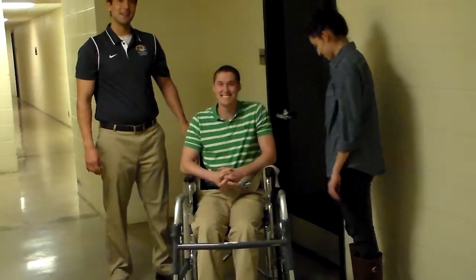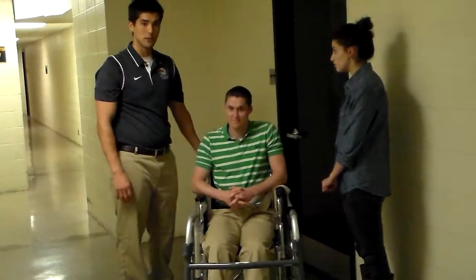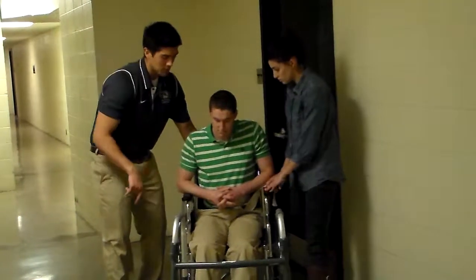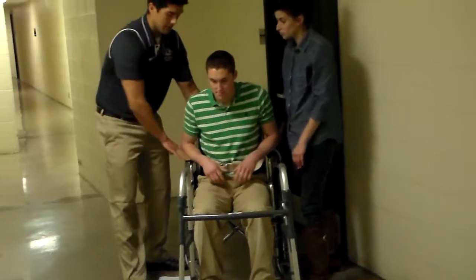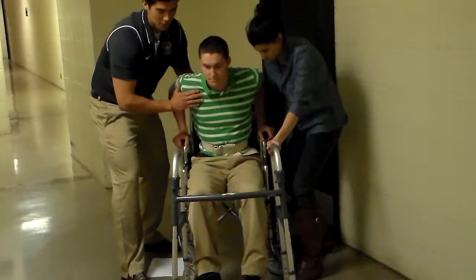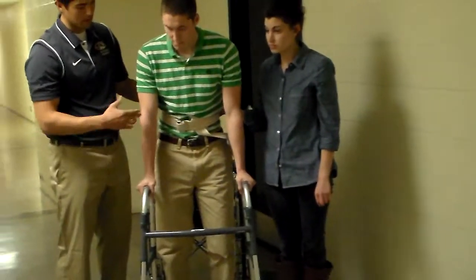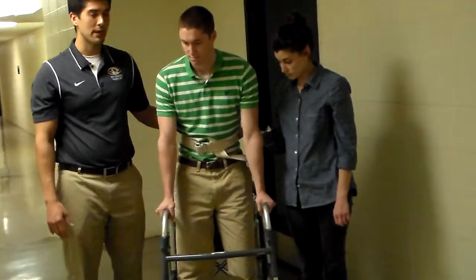So it's important that to get from a sitting to a standing position, you provide enough support, which would require you to place your hand on a gait belt and guard his shoulder. You want to instruct the patient to scoot up to the edge of his chair and push off of his armrests with his hands. We're going to do that on a count of three — one, two, three. And so of course the proper fit would be the handles putting Kevin's elbows in about 20 degrees of flexion, but unfortunately this is the tallest walker we have available.